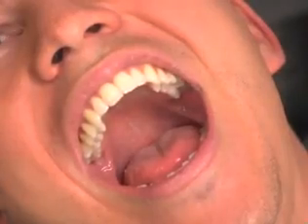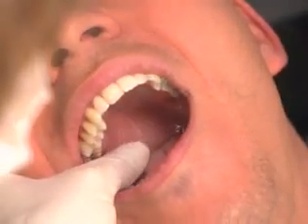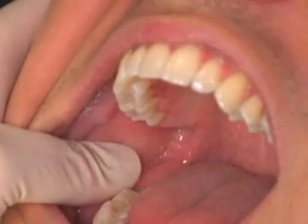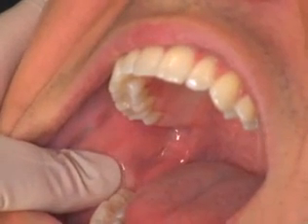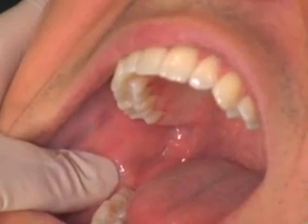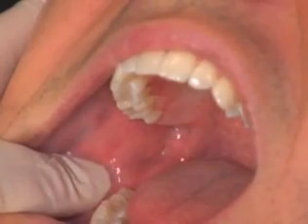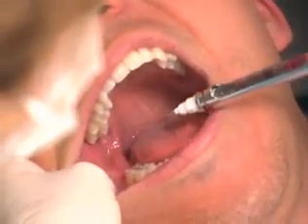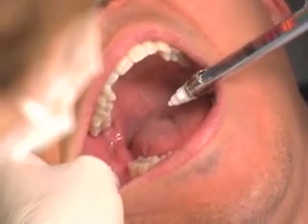A finger is placed on the lingual aspect of the ramus and pulled anteriorly until the coronoid notch is palpated. The coronoid notch is the greatest concavity on the anterior border of the ramus. The barrel of the syringe is placed in the corner of the mouth on the opposite side.